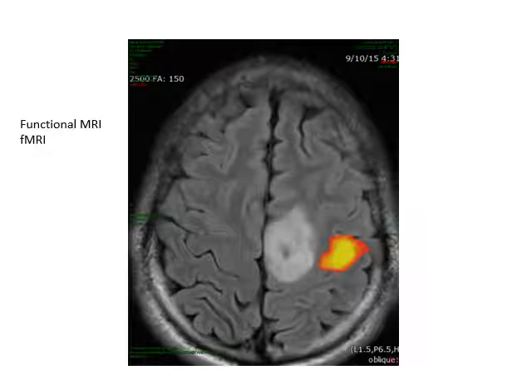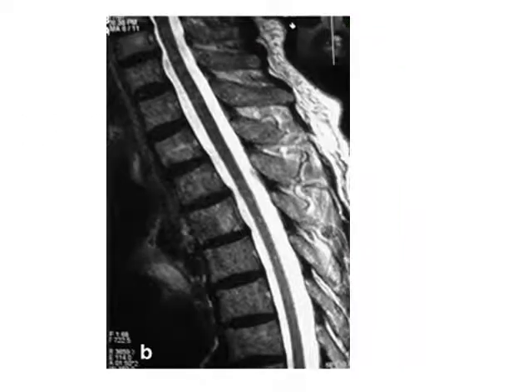All right, and then you'll always hear stories about they put people in an MRI and they let them listen to music and certain parts of their brain lit up. So that's what a functional MRI will do. It'll show you what parts of the brain are actually functioning when you're doing a certain activity. Okay, so here we go.